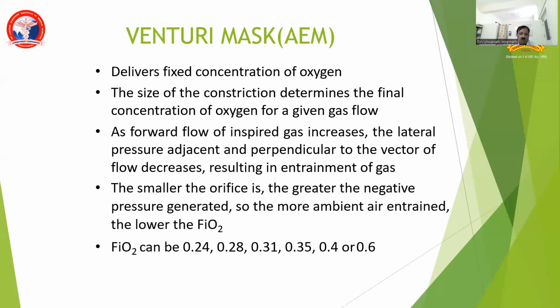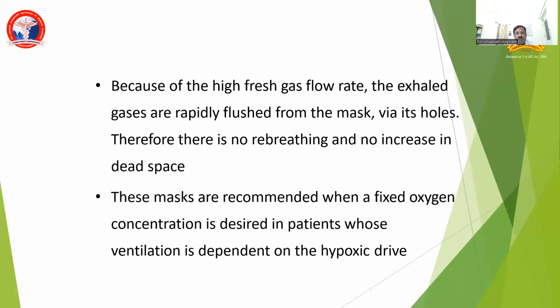Air dilution occurs, so the FiO2 falls. According to the principle, the smaller the orifice, the greater the negative pressure generated, so more entrainment and air dilution occur. So the harmful effect of the higher FiO2 is reduced. Because of the high fresh gas flow rate, exhaled gases are rapidly flushed from the mask via its holes. There is no rebreathing and no increase in dead space.